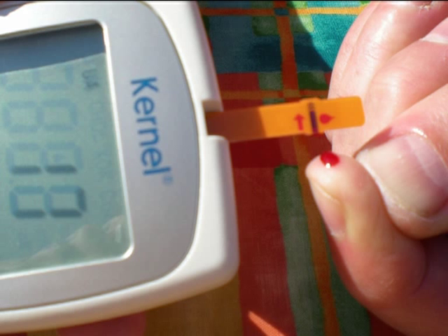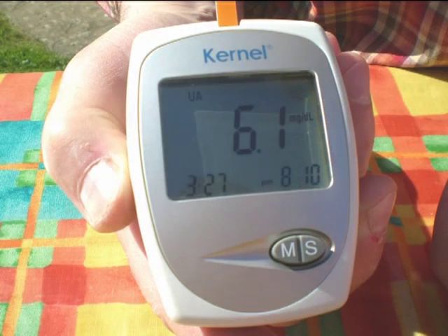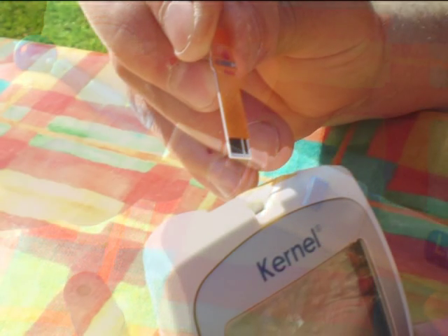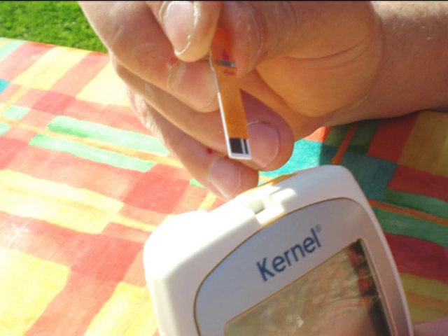The meter then counts down to reveal your reading. Remember to check the instruction booklet for a full explanation of what your reading means. Once you have completed the test, it is very important that you dispose of the waste carefully, placing the protective top back on the lancet capsule before discarding it in an appropriate container with a lid. To switch the meter off, simply remove the test strip and dispose of it.